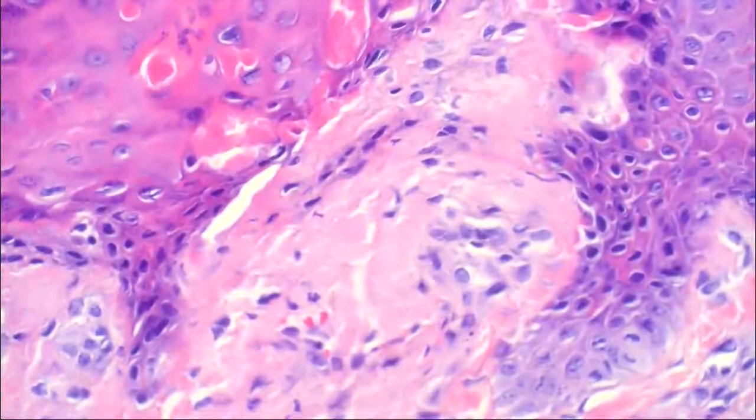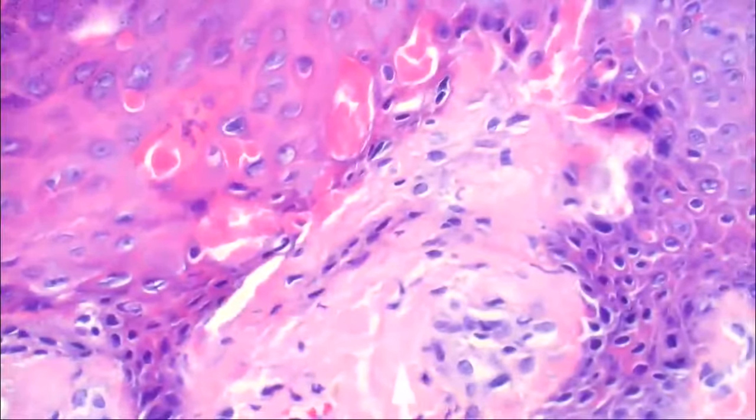That would be the nodular type. Yeah, we wouldn't want to do it for this type, would we? No, it'd be a big expensive workup and all sorts of stuff. For this one, where does this amyloid come from?